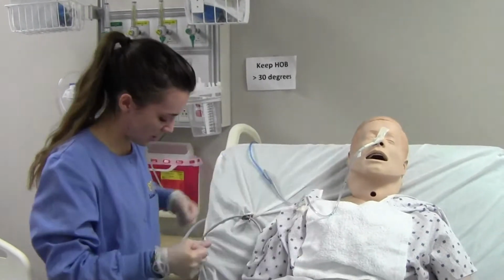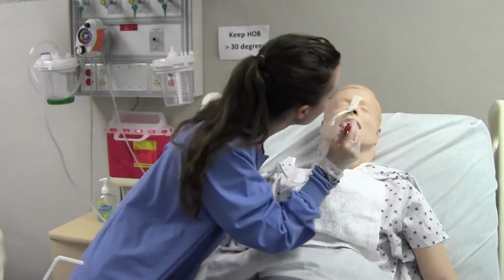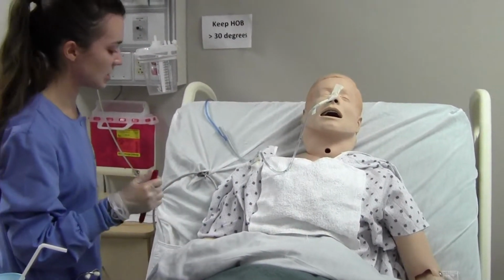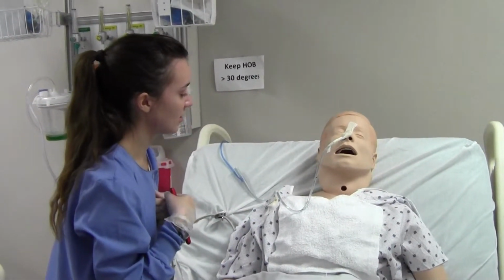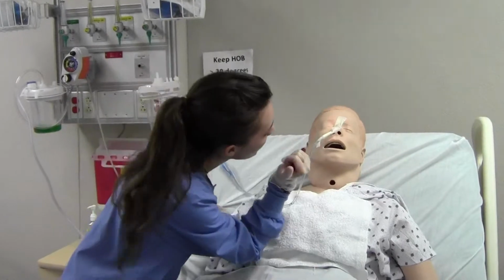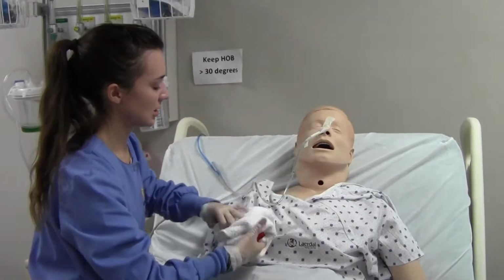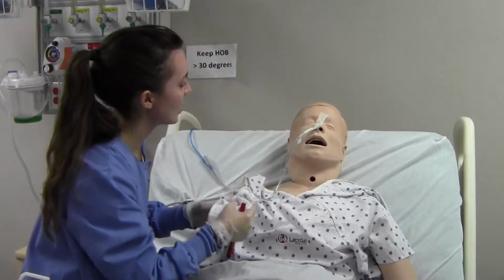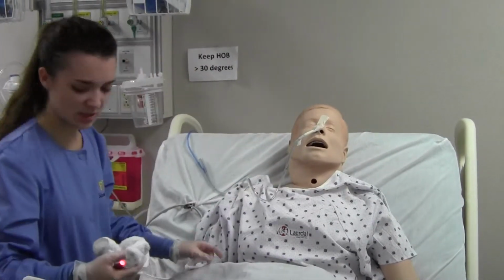Okay, Mr. Templeton, I'm going to do another little assessment. How are you feeling? Can you breathe? Can you talk okay? Everything looks good in the back of your throat. Your stomach contents are coming out intermittently. Alright, how are you feeling? Okay, you're handling the procedure alright? Okay, wonderful. Is your nose okay? Everything's looking good there. Excellent. I'm going to actually take this. I'm going to wipe any residual from the lube that we have. Very good. You didn't spit up at all. That's excellent. Have that pinned in.